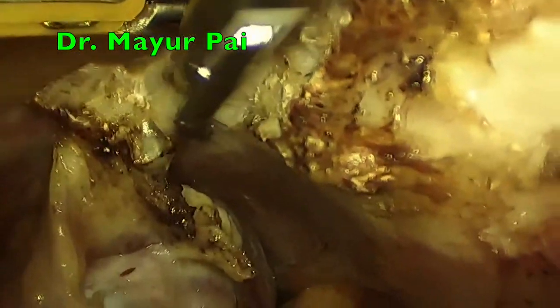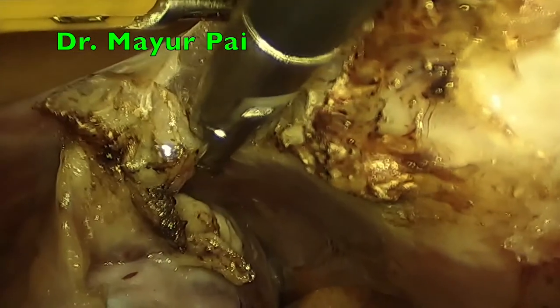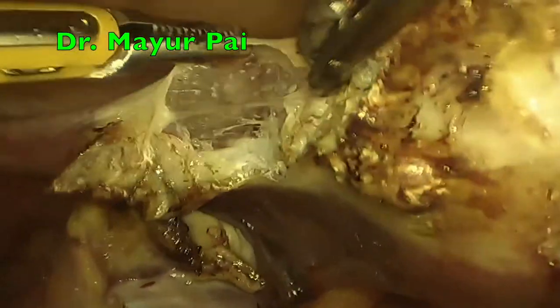Here we are opening the anterior leaf of the broad ligament, which would help us to complete the cutting of the broad ligament and the round ligament.